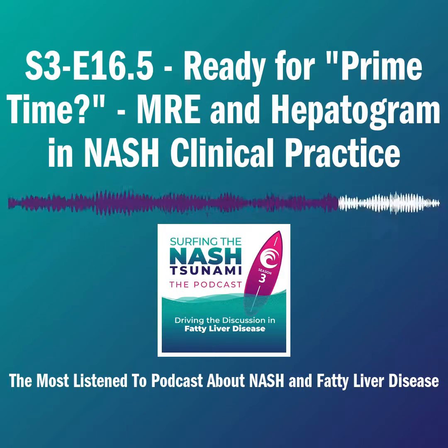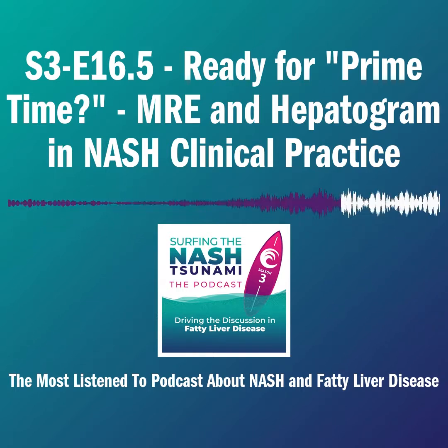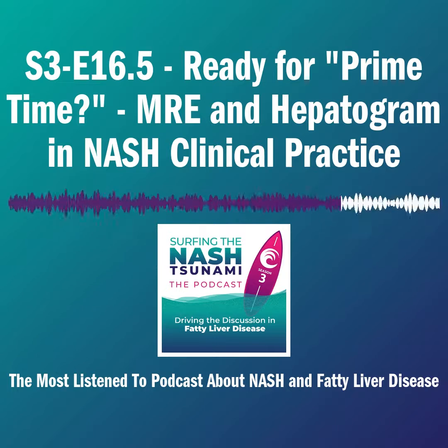Go ahead, Louise. Because I think it was Scott that commented on reading iron within the liver, particularly for FibroScan and things like that. We use it said that iron can interfere with the score and the potential stiffness, and therefore you can't read it particularly well. Have you ever seen any correlation between high stiffness and high iron, or with the MRE? Is that able to pick that out so that it could help us in our hemochromatosis patients?